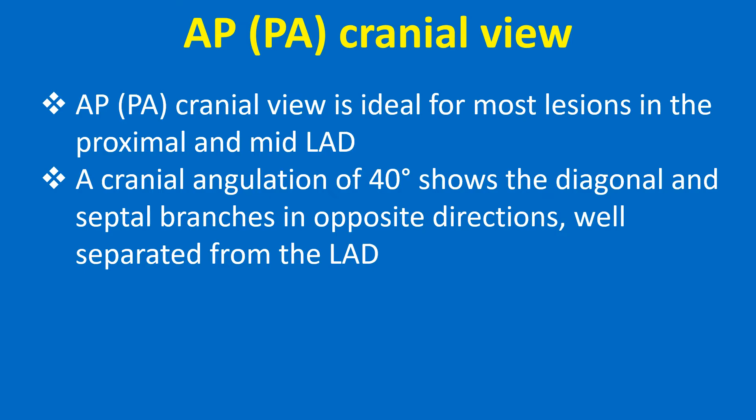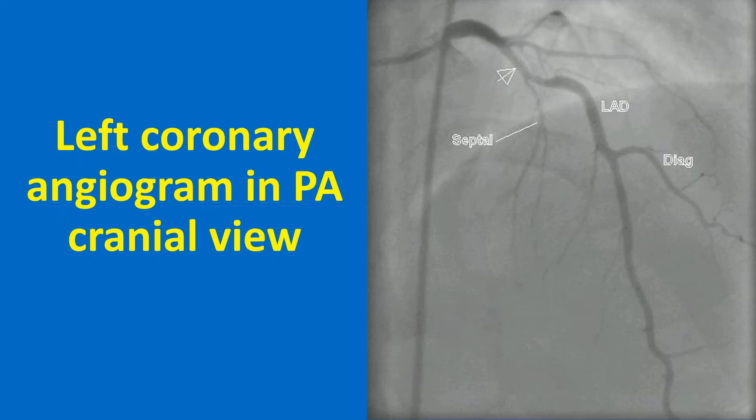PA cranial view is ideal for most lesions in the proximal and mid LAD. A cranial angulation of 40 degrees shows the diagonal and septal branches in opposite directions while separated from the LAD. A left coronary angiogram in PA cranial view shows a proximal plaque marked by an arrow in the LAD — in this case a recanalized vessel after an anterolateral myocardial infarction. Septal and diagonal branches of LAD are also seen, and almost the whole extent of the LAD is visualized. The proximal left circumflex is foreshortened in this view.